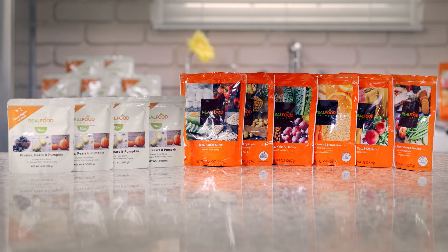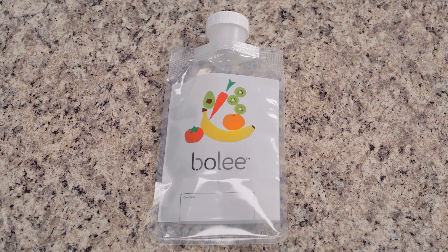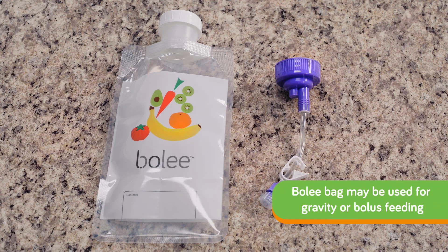Today, I'm going to show you how to administer real food blends using a Boley bag, which is a reusable nutrition bag. What is unique about the Boley bag and the Bolink large cap is that they can be used for gravity or bolus feeding.